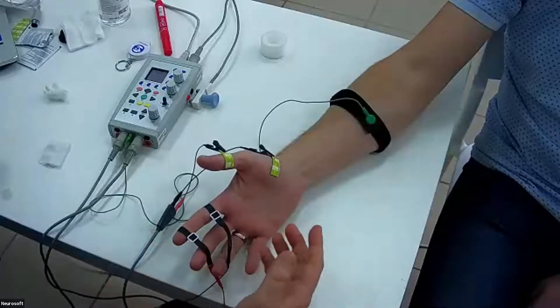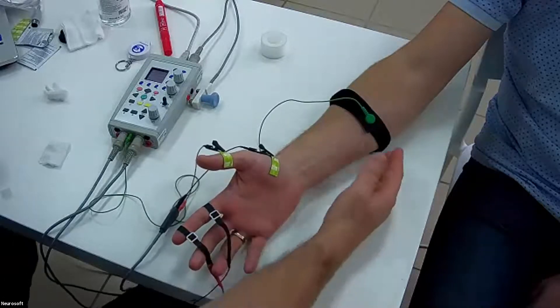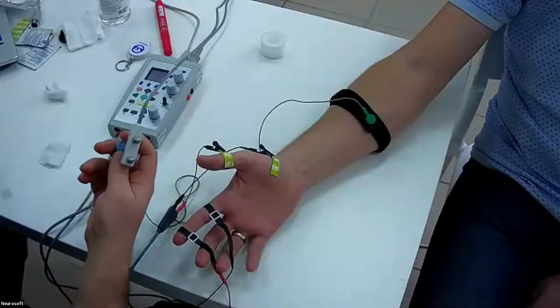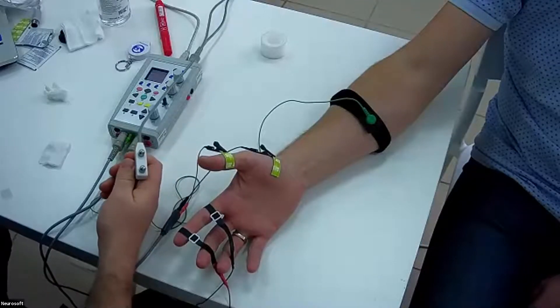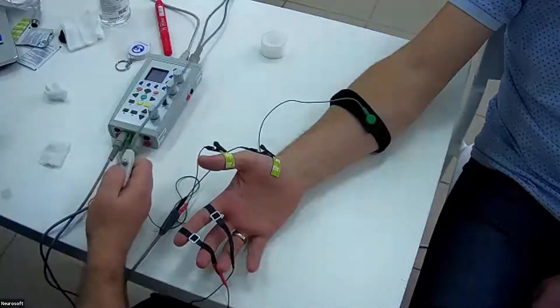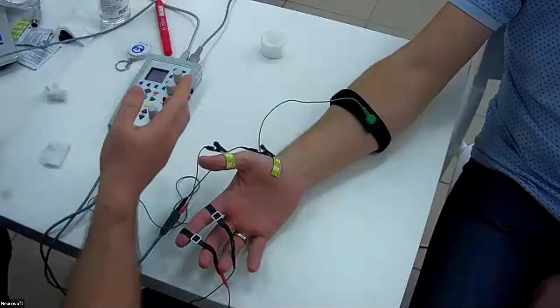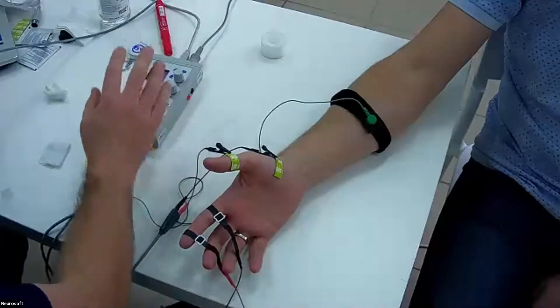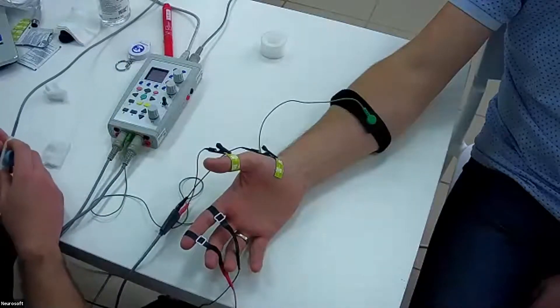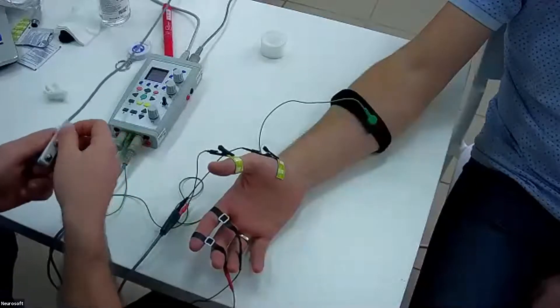You can now see the recording electrode for motor conduction velocity, the one for sensory conduction velocity, and the ground electrode. For stimulation today we use a bar electrode. Some doctors prefer an adjustable probe that lets you control different parameters directly from the probe, but we will use the classical bar electrode and control the EMG examination mostly from the keyboard, though it's also possible from the laptop screen.